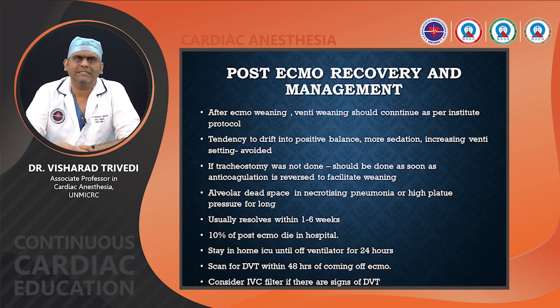Alveolar dead space in necrotizing pneumonia or high plateau pressure can be increased, because the patient was remaining on very high inspiratory pressure and high plateau pressure throughout this ECMO period. So there is a chance of increase in the alveolar dead space. So you have to keep that in mind also.